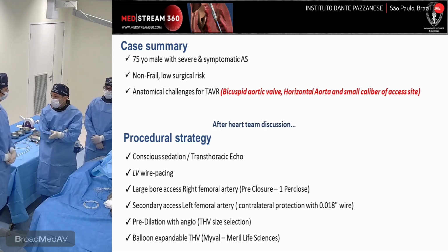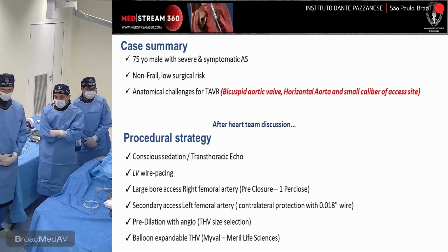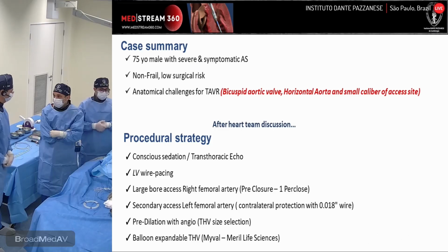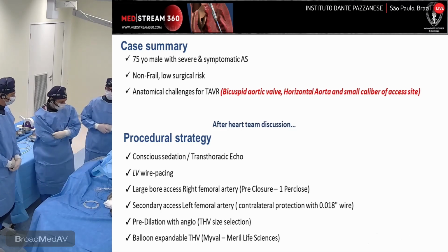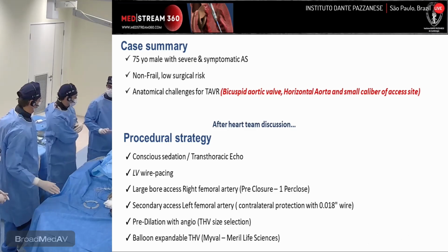So we are going ahead with the indication for this. We discussed this case during our heart team meetings, and as you can see, we selected this patient for TAVR, and we're going to show you. Okay, good. What have you done so far? Alberto, what have you done?